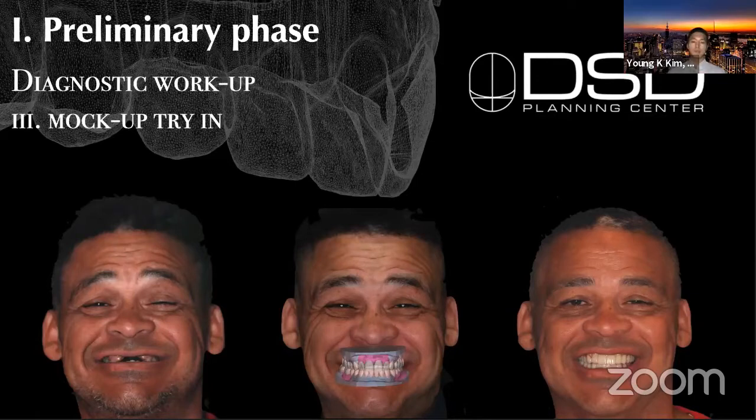In this case, I saw him about 3 weeks ago for full mouth prep and temps of the maxilla and mandible, and we took a DICOM CBCT. He's fully ready for implant placement in 2 weeks. So if you have a scanner and the beauty of digital technology, you can use it. But again, the foundation part is also critical.